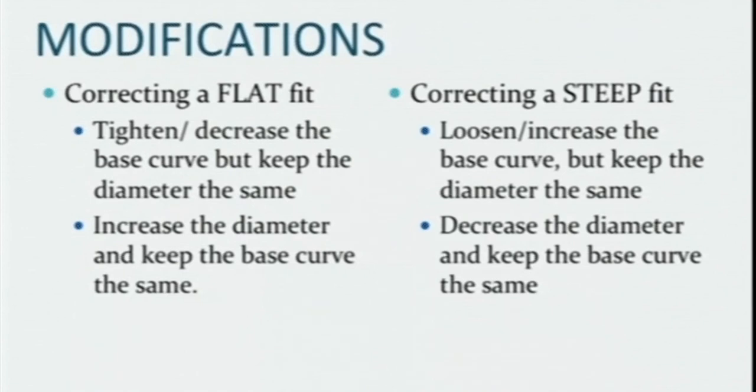How do you modify this? If it is going to be a flat fit, tighten and decrease the base curve, but keep the diameter the same. So it will be inversely proportional. And if you are going to increase the diameter, keep the base curve the same. And opposite is the steep fit.